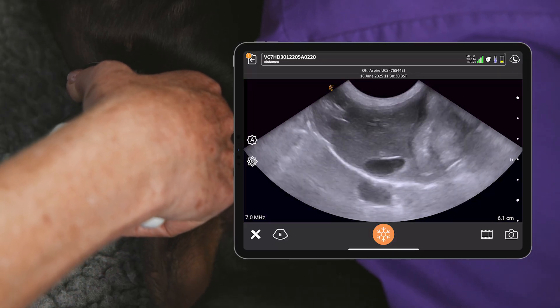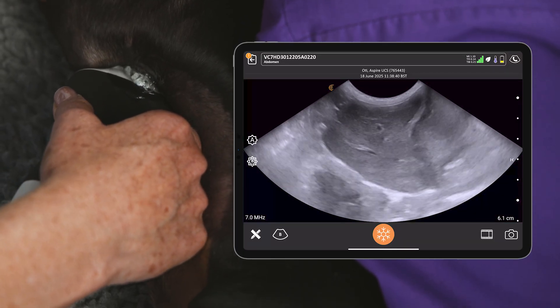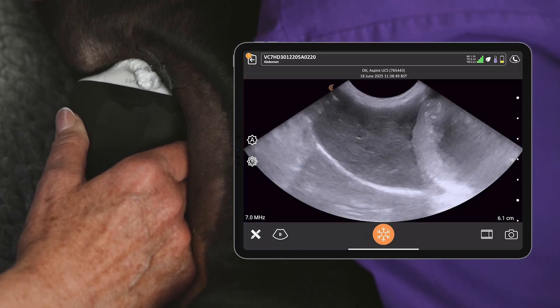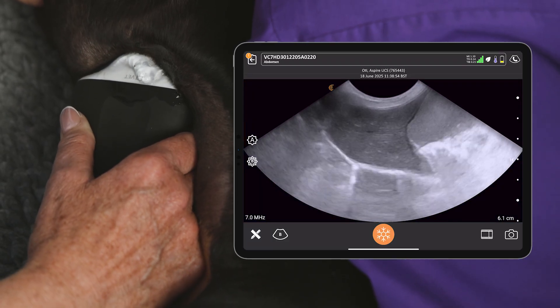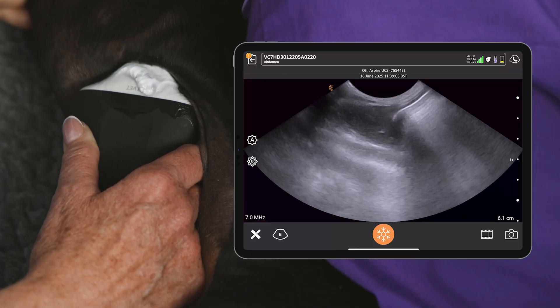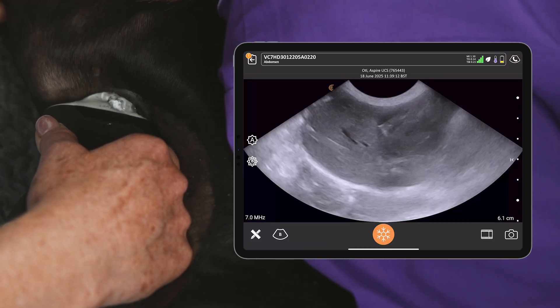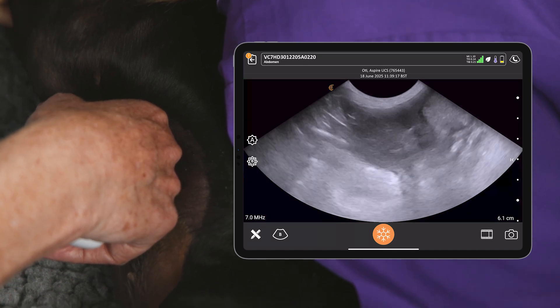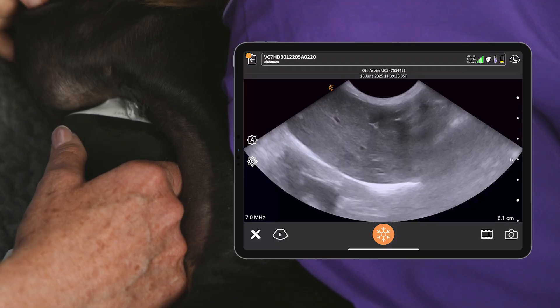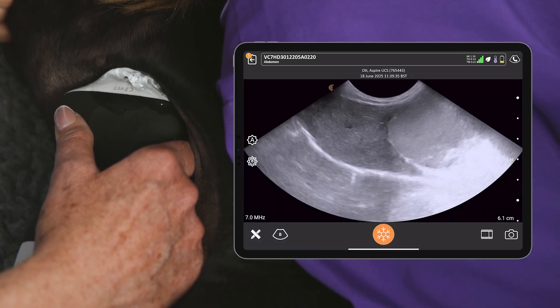That's important for any organ that you look at. In long axis we've gone all the way through — you can see we're running out of liver — and then coming back as I tilt my hand back to horizontal. This is the midline, so now we start looking at the left lobe of the liver as we tilt up towards Lily's left shoulder. We carry on scanning until we almost pop off the rib and run out of liver. We want to be looking at the parenchyma, the outline, making sure there's no intrahepatic duct dilatation, no abnormal vascularity or anomalous veins that might suggest a shunt. We're also looking at the size of the liver — are those caudal margins pointy, or are they rounded, which might suggest some enlargement?